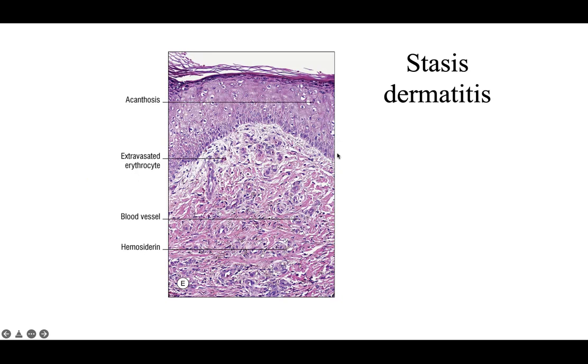You can also just have chronic lichenified changes. You can have more subacute changes with alternating parakeratosis. So it really just depends on which spot you biopsied on the patient clinically, how long it's been there, et cetera.